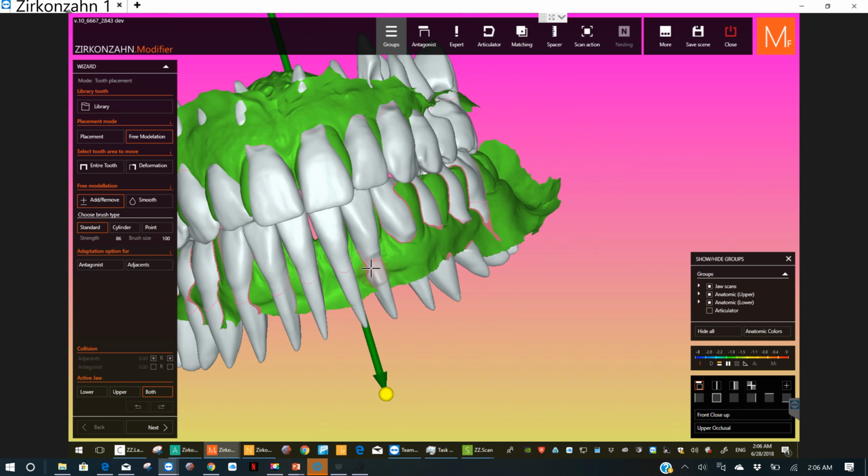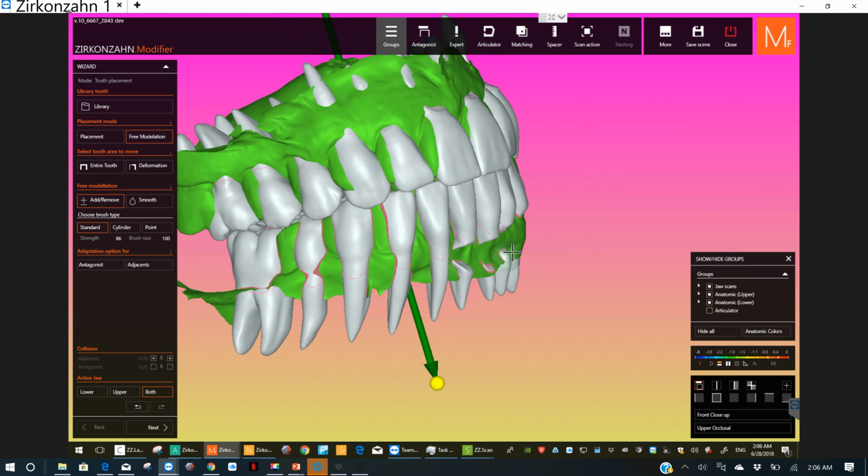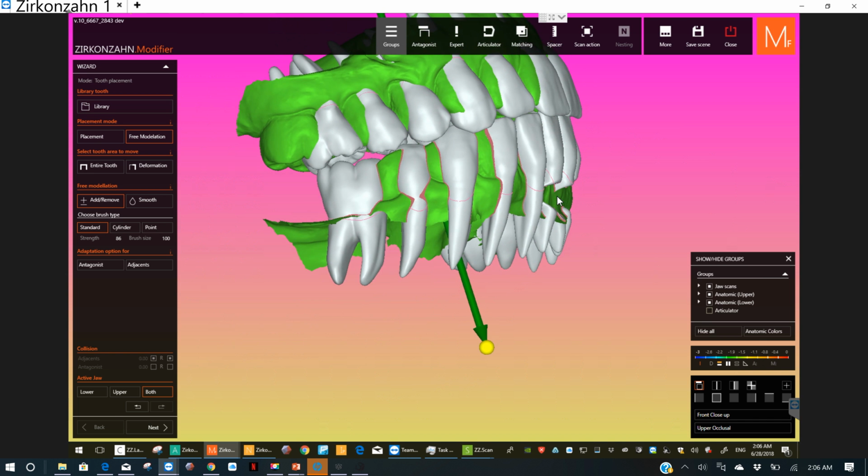So I'm just kind of making a little spot here to draw my margin. We have to draw a margin where we want our snap-in to go, and this thing will break apart. It needs to have a little bit of thickness to it, so I want to have a little layer of flash that goes on that we could possibly remove later, or just leave it so it feels a little bulky, and they'll be pleasantly surprised when their bridge isn't that way. So that's going to be a big irritant right there, so I do have to blend that back.